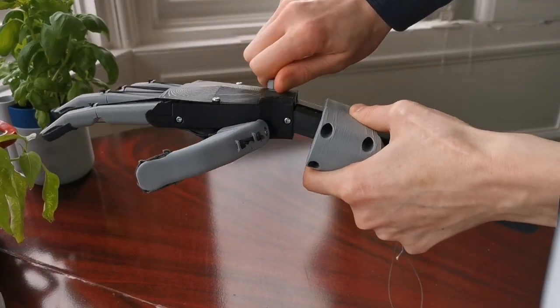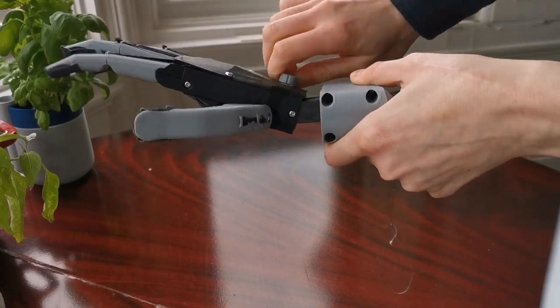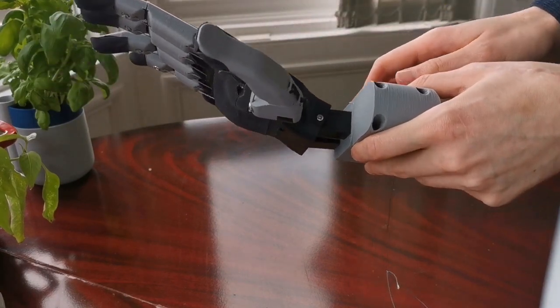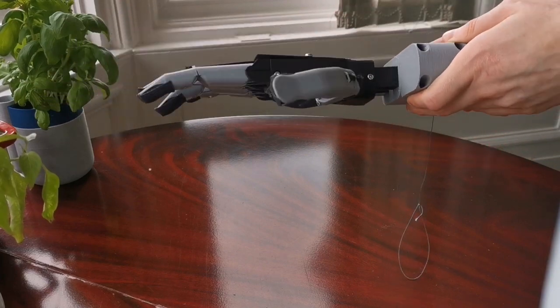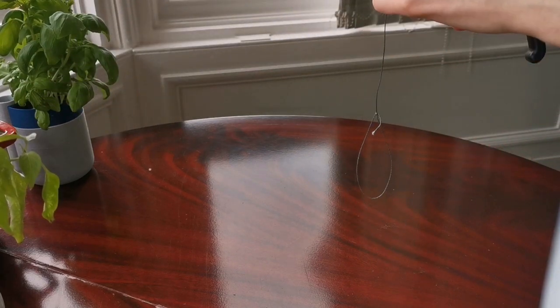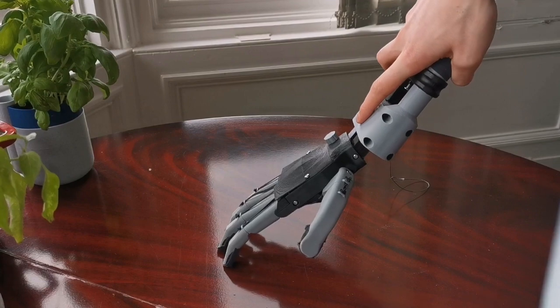First off is wrist flexion and extension. This operates from a simple toggle on the back and ensures that users don't have to assume awkward body positions to achieve what are typical tasks.